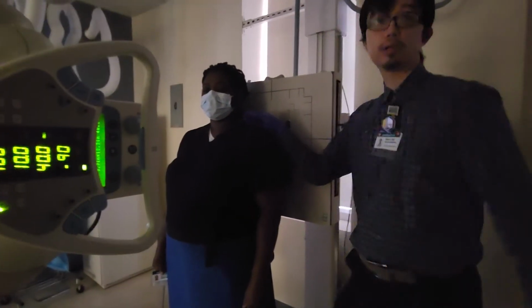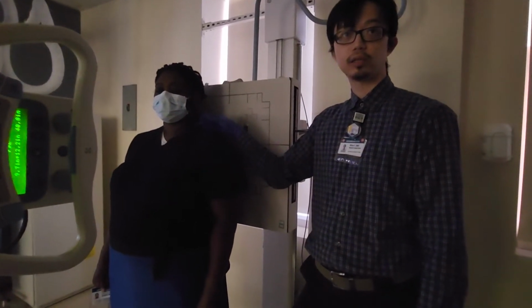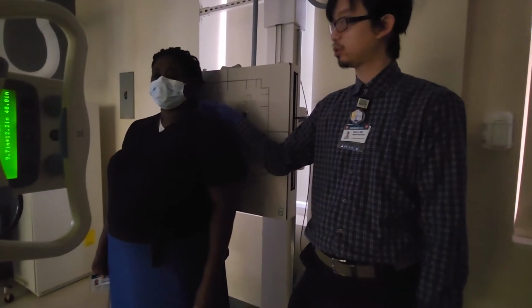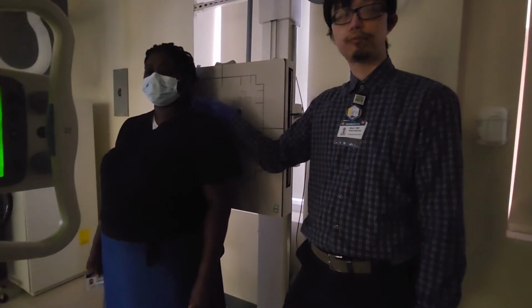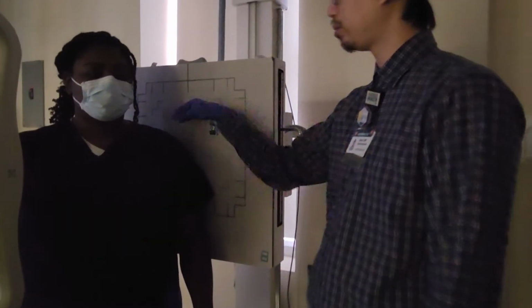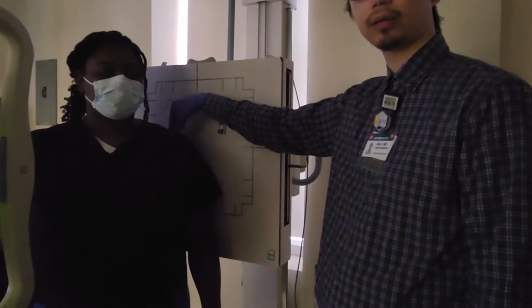So in this case, we need to oblique our patient. For the Grashey, the shoulder of interest is going to be the one closest to the IR. In this case, we're going to do an LPO. So, Shamika, I'll just turn slightly towards me. A little bit more. Good. So, this is going to be around a 45-degree oblique. And by doing that, we're going to open up this shoulder joint right here.